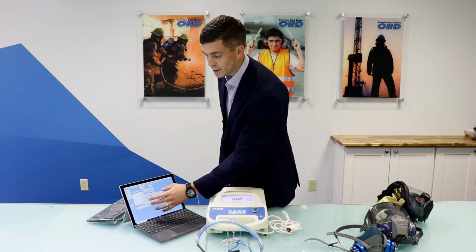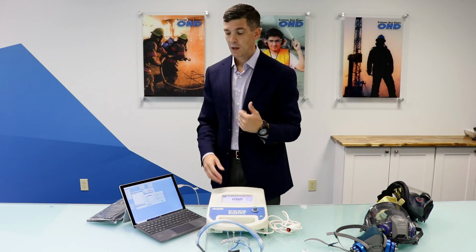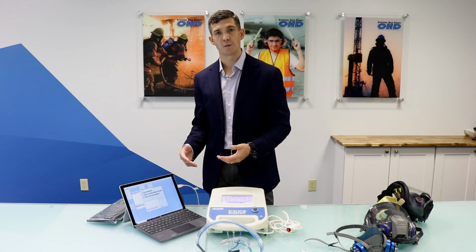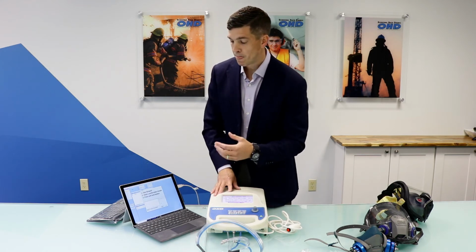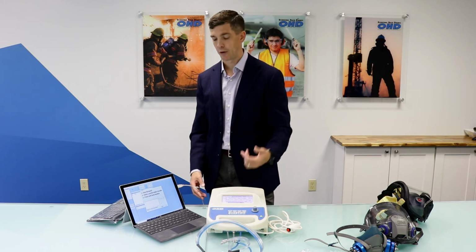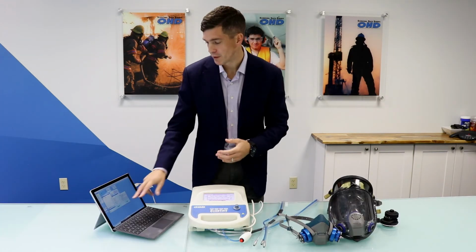So what we'll do now is we'll hit start test. We should hear the tone on our instrument. That lets us know that it sees it, it recognizes through our USB connection, and we're ready to go. That is one thing I didn't mention: the USB port on the back, which we talked about earlier, just straight up connects to a computer through the USB. So now we're going to start our test.